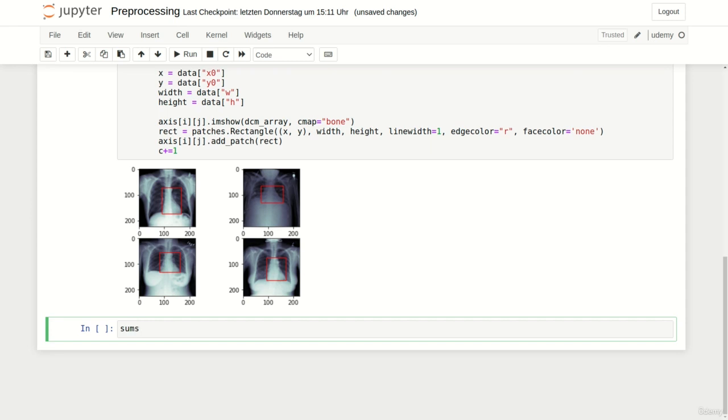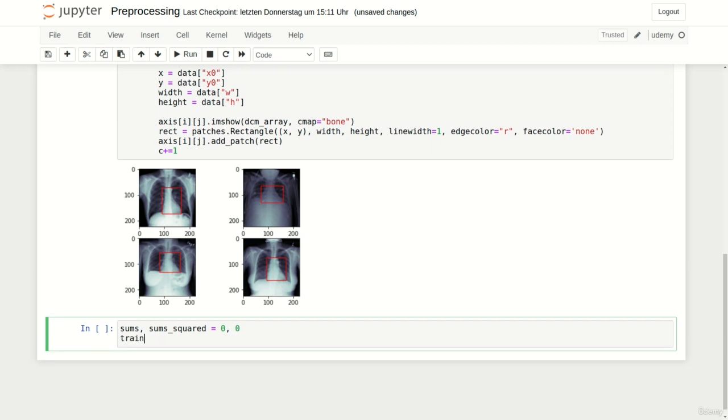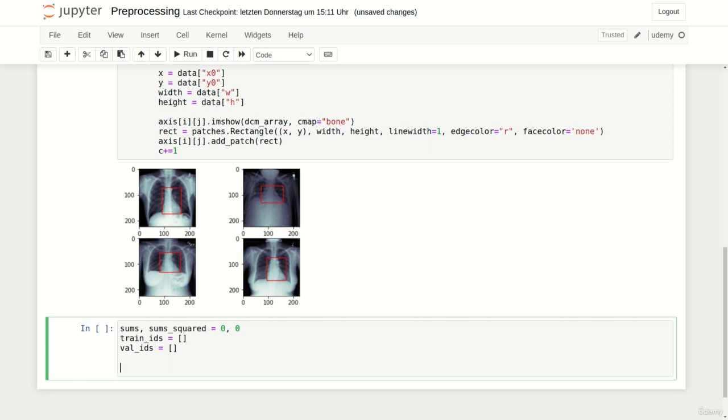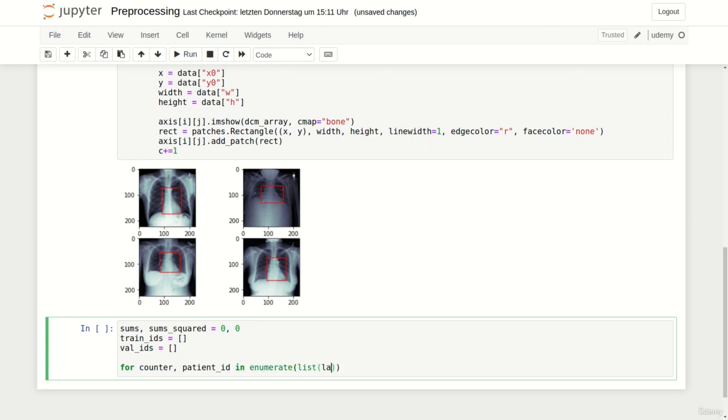At first we define our sums and sums_squared variables to compute mean and standard deviation later. Of course we initialize them both to zero. Next we create two lists called train_IDs and val_IDs to store our train and validation subjects. Now we can define the pre-processing loop. We code it in the same way as we did in the classification lecture but without TQDM because to be honest you don't really need a progress bar when only working with 500 files. So let's write for counter, patient_ID in enumerate of list of labels.name.